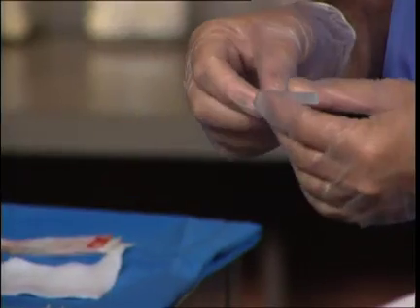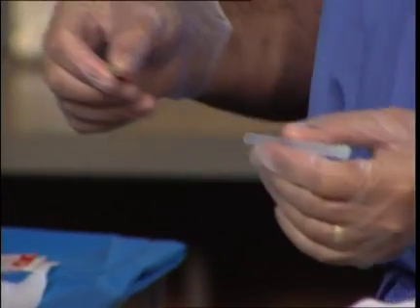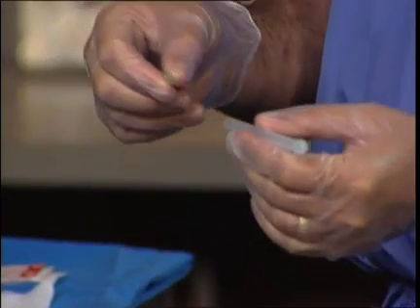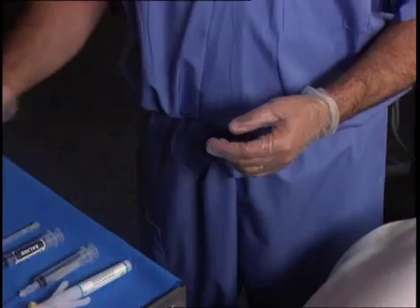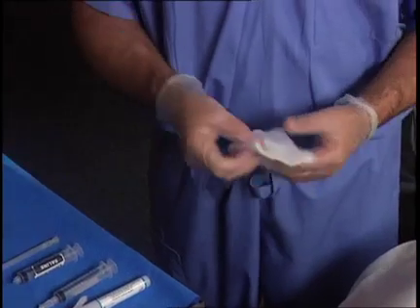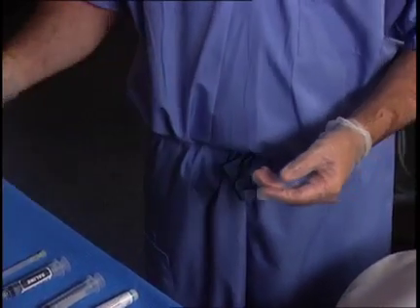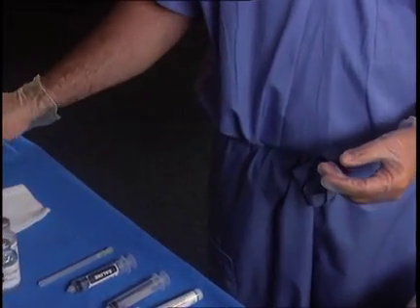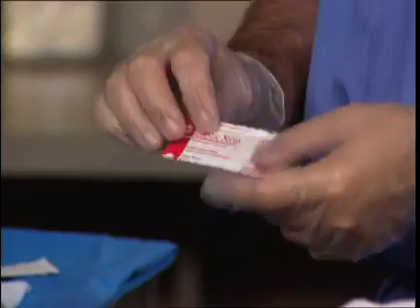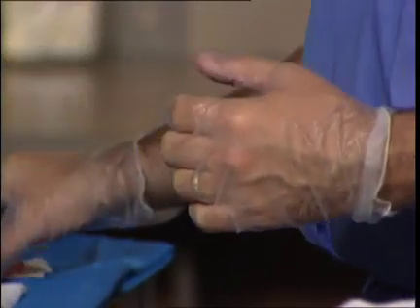The needle utilized to enter the space is a 3.5-inch spinal needle. For the conclusion of the procedure, it will be necessary to have sterile 4x4 gauze for cleanup, and then a simple band-aid will suffice to cover the entry site.